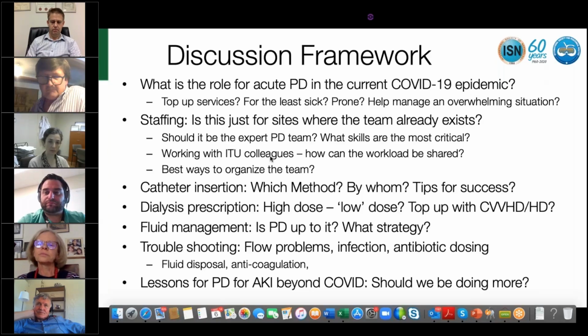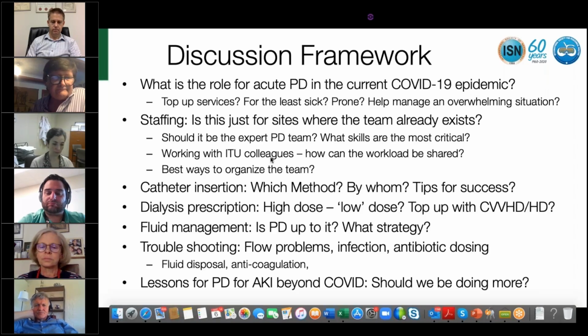I think my relearning in this is that we should have done maybe more training of the actual intensivists and get them not to be so afraid of the machines. A very simple thing like paging down to find out the current UF was something they found very frustrating, not knowing it. But of course, all you need to do is page down a couple of times on the machine and you see what the current UF is, the running UF.